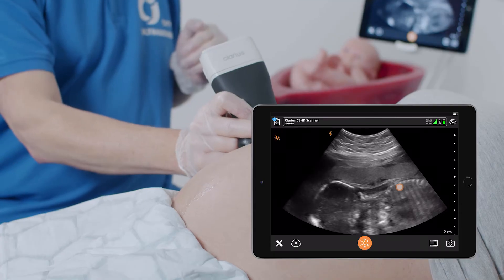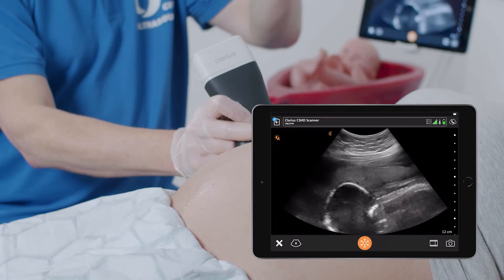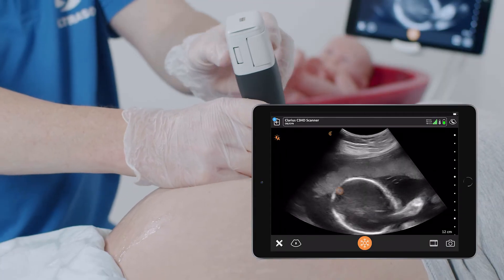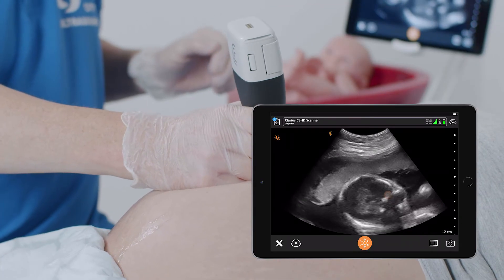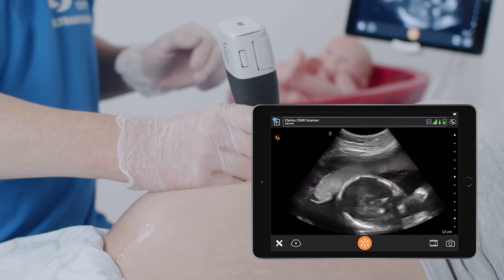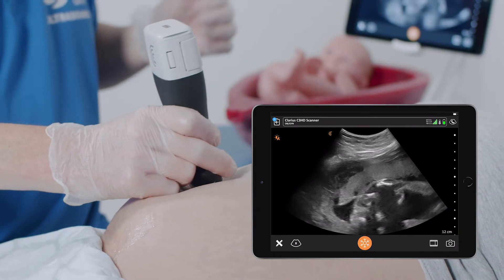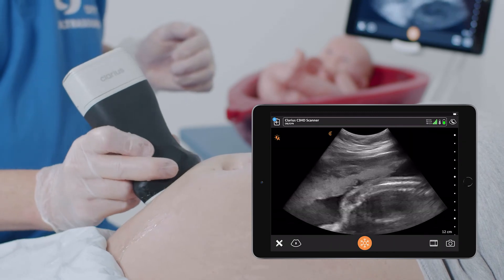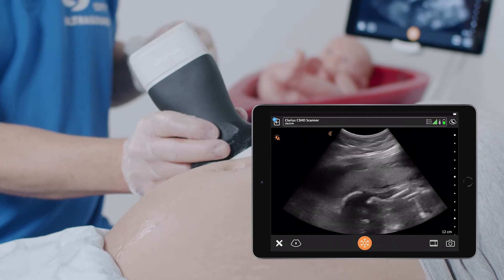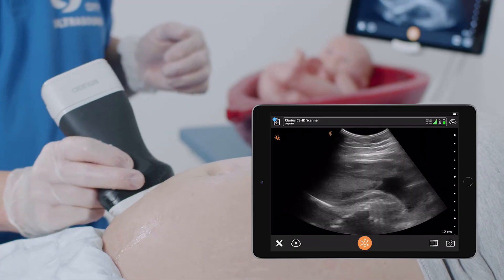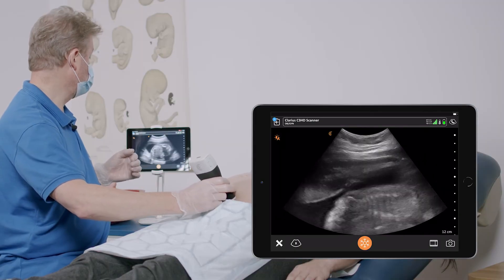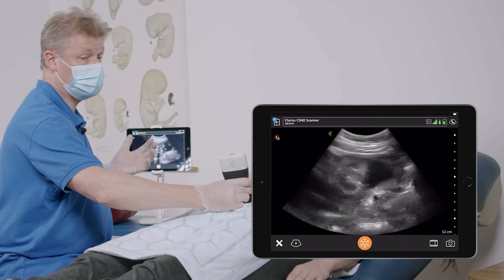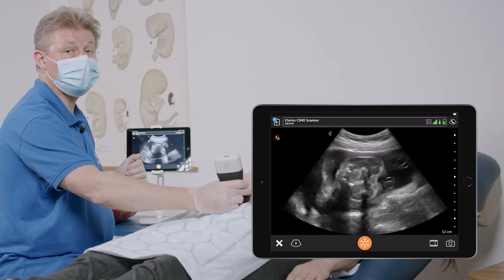The spine is going this way and the baby is facing the maternal back. Here I can identify the head. So the baby is in breech presentation, with the spine going to the right maternal side. This is a very simple way to detect and recognize breech presentation.